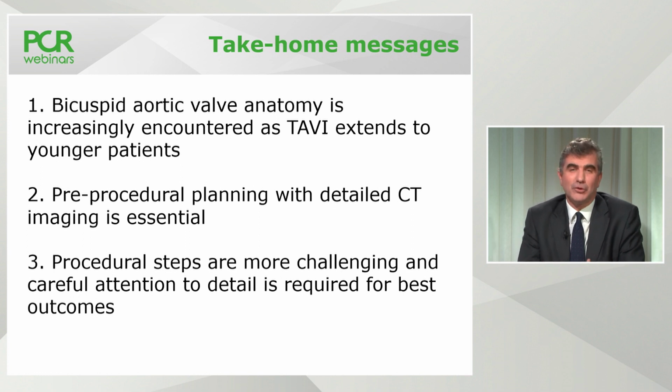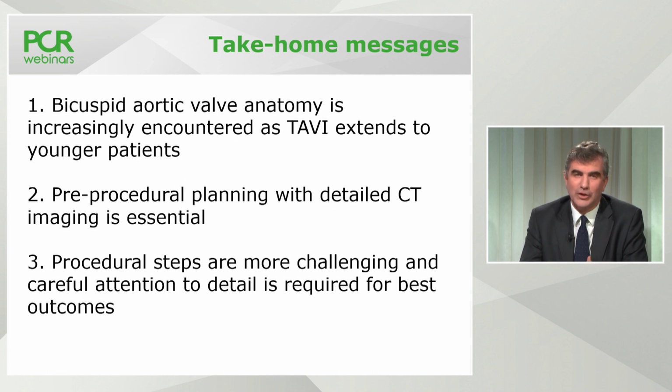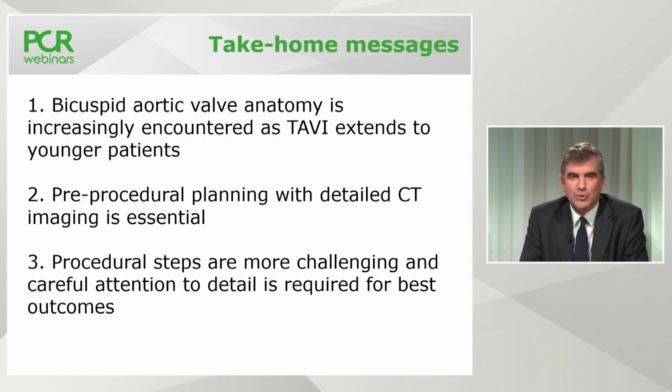And something that we haven't focused on in great detail: the iliofemoral anatomy, its tortuosity and its suitability for transfemoral access. And finally, with the help of Marcus's nice teaching cases, we realise that the procedural steps can be quite challenging. There's a need for an increased repertoire of crossing catheters, and to use a balloon for pre-sizing in many cases and pre-dilatation, particularly if you're using a self-expanding valve. These very careful steps of attention to detail are fundamentally important to achieve the best outcomes for our patients.